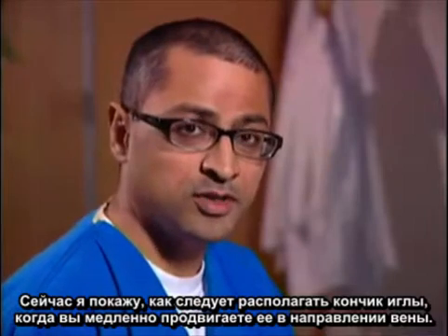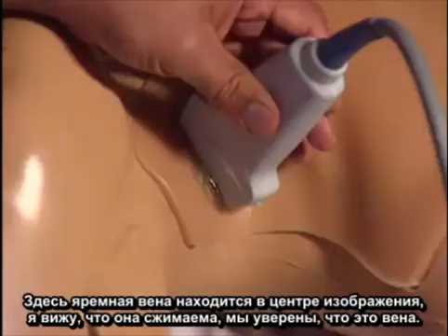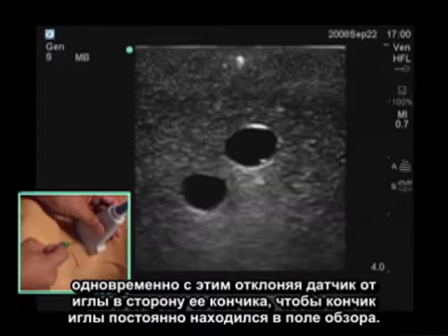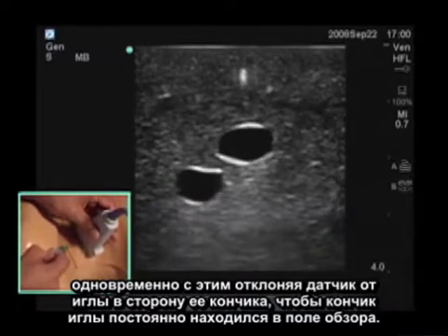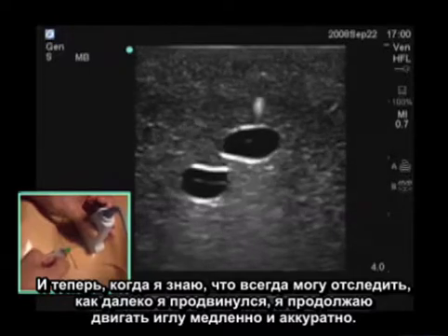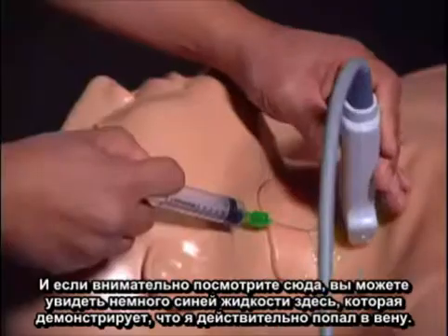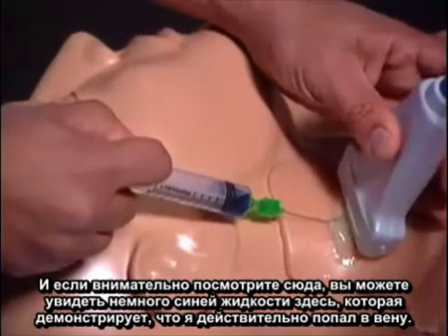I'm going to show you how to follow the needle tip as you slowly march toward the vein. I have the jugular vein centered in the image — you can see it's compressible, so we're sure it's the vein. I take my needle and place it right adjacent to the transducer at the mid part, so we can see the needle tip. As I slowly advance, I'm angling the transducer away from and then toward the needle tip, so I always keep the needle tip in the field of view and can track how far I've gone. And you can see I'm getting closer to the vein — I've actually hit the vein. If you look closely, you can see a little bit of blue liquid, which demonstrates that I've successfully cannulated the vein.